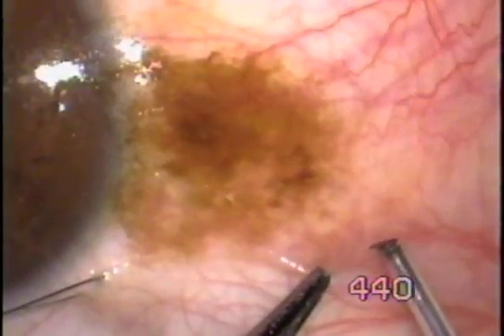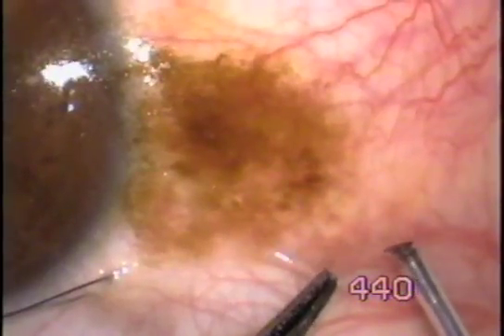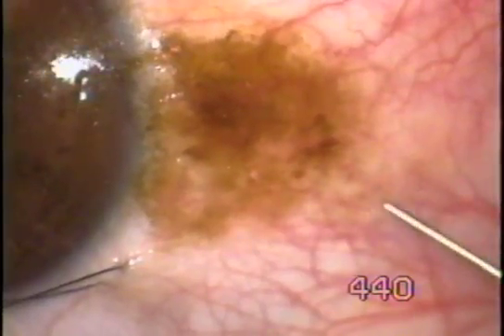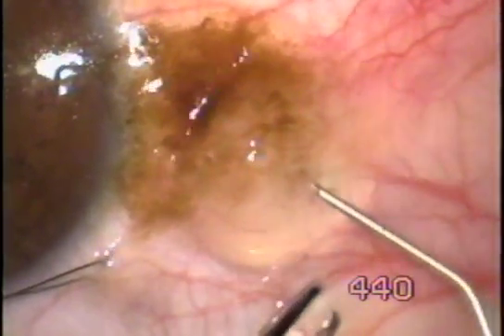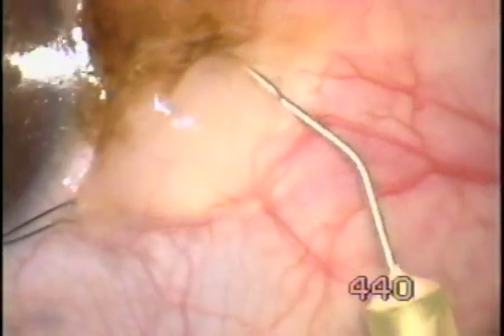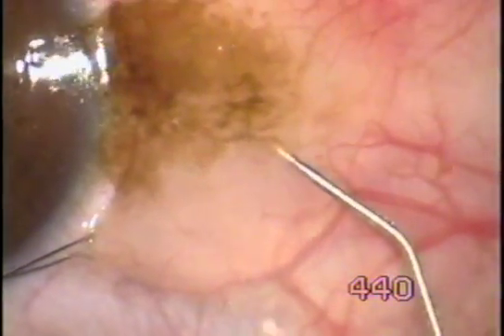A 100 micron fugoblade tip is used to make a hole in the conjunctiva. From here, we inject local anesthetic, lignocaine 2%.